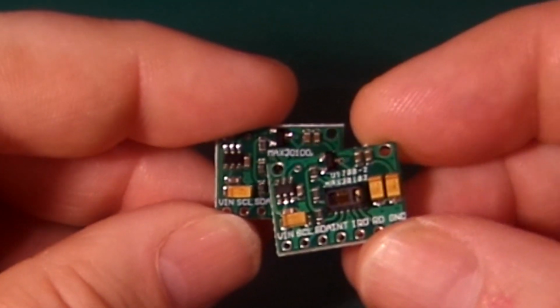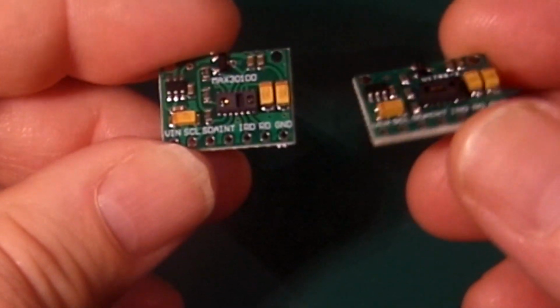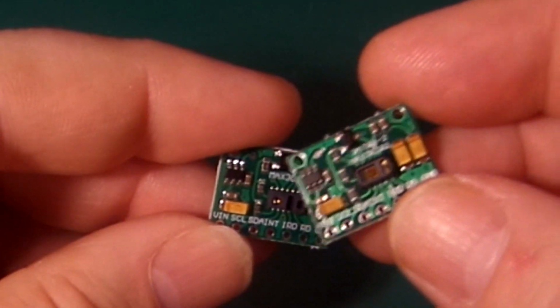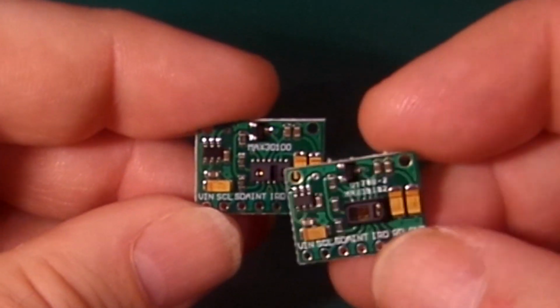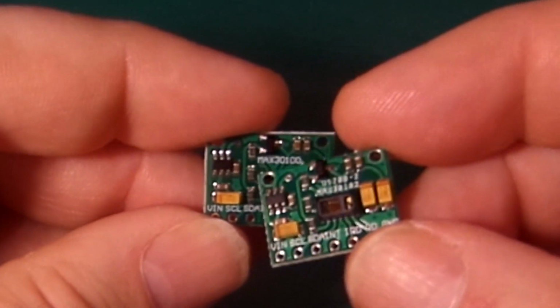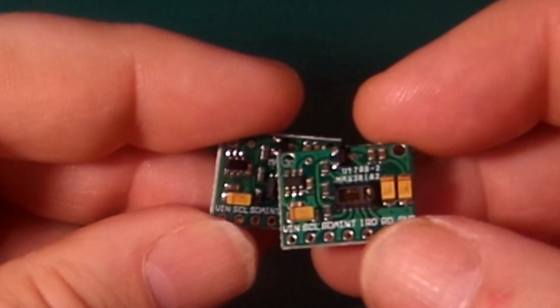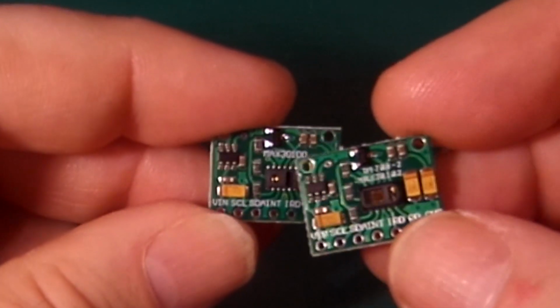Basically, these three resistors here have to go. It's because this is basically a 1.8 volt chip. Obviously our Arduinos are 5 volts. There is a regulator on board that reduces it down from 5 volts to the correct voltage. However, the I2C bus on these is still operating at 1.8 volts. And just with that slight adjustment of taking these resistors out, we can actually make it talk to our Arduino. So it's not a biggie. I mean, most of us will have a soldering iron, just that they are surface mount and very tiny. But I'll go through taking them off as I do.